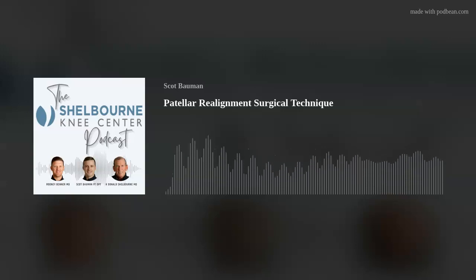You can kind of taper it at the end and then just push it over. A lot of times you can just crack it by pushing it over if it's really thin on the distal end of that. And then once we've pushed it over and gotten it to the area that we want, we stick a K-wire in it, and that gives us provisional fixation. Then we take out our plate, make sure we have the appropriate size plate that we want to get the screws where we want, with one screw distal to the osteotomy and more, and then the rest along the course of the tibial tubercle in lag technique.